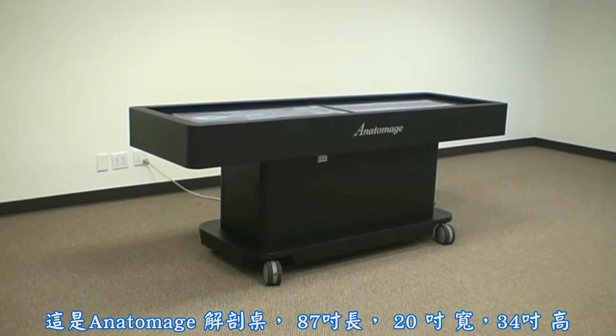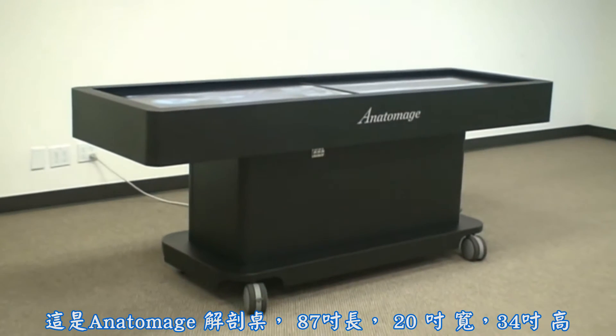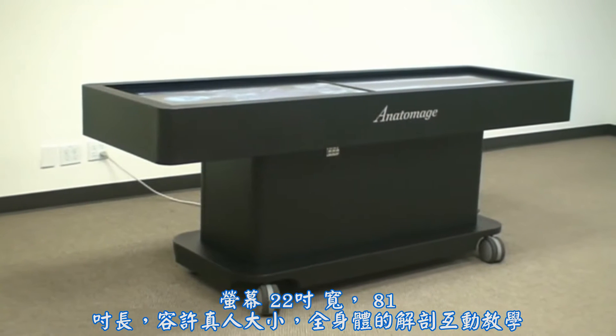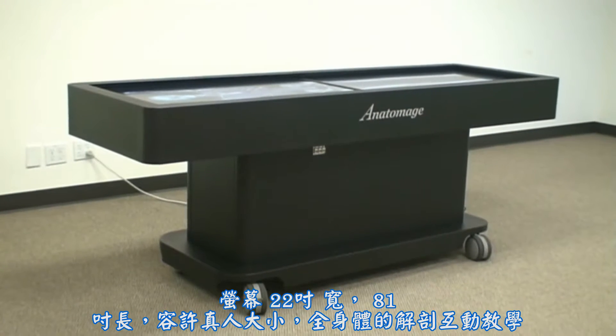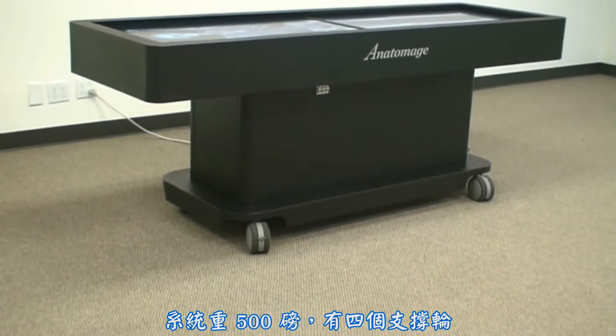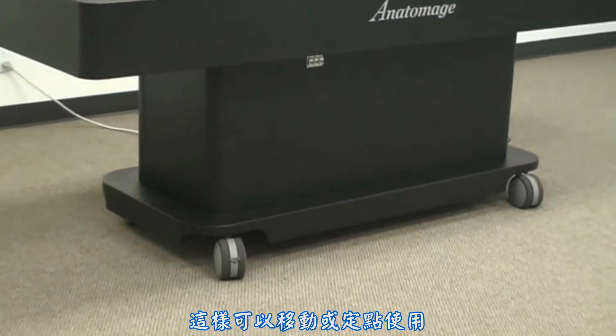This is the Anatomage table. It is 87 inches long, 28 inches wide, and 34 inches tall. The screen is 22 inches wide and 81 inches long, which allows for life-size full-body anatomy interaction. The system weighs 500 pounds, but is placed on four casters equipped with brakes, allowing for both mobility and stationary use.